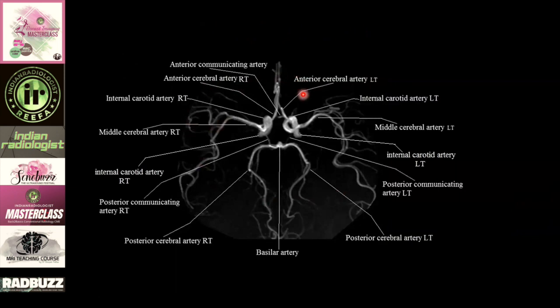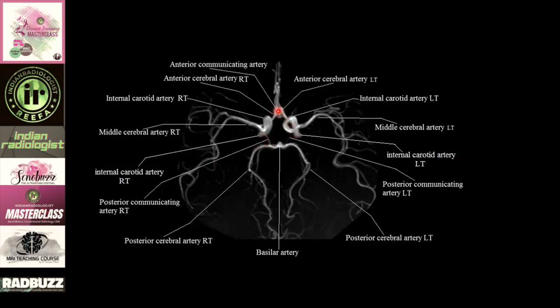This is a routine time-of-flight reconstructed image you see whenever you perform your MR angio for the brain. Here you can identify the components of the circle of Willis. This one is the middle cerebral artery; on end-on view is the anterior cerebral artery. The internal carotid artery is better seen on coronal or sagittal sections. Here you have the posterior cerebral artery, and completing the circle are the posterior communicating arteries. Anteriorly, the anterior communicating arteries connect the two anterior cerebral arteries, creating complete circulatory overlap in the brain.